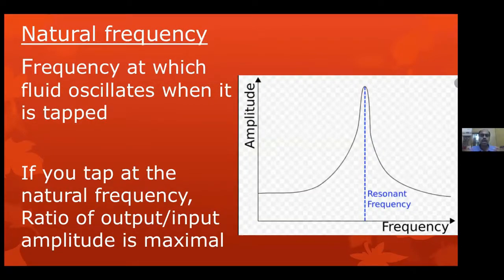Now, this is the frequency that is happening in our body. Now we are detecting it with the fluid-filled transducer. So the transducer should have an ability to respond to the oscillations that are happening in our body. Now if you see this curve, this is the frequency and this is the amplitude. Amplitude is the output to input ratio. That means if I am able to give one input frequency and I am able to get the same amount of output frequency, that means the amplitude is roughly 1.